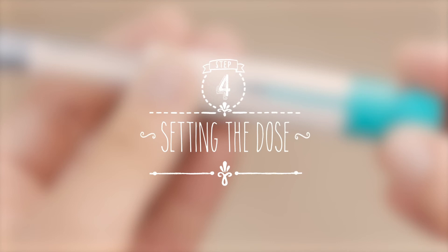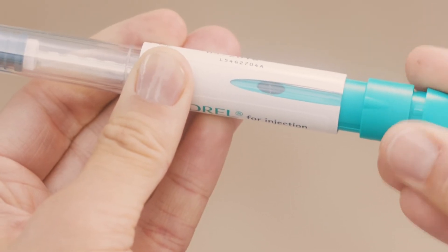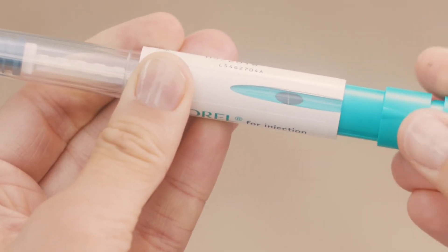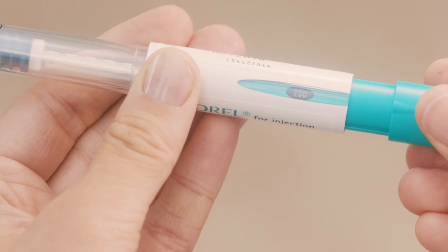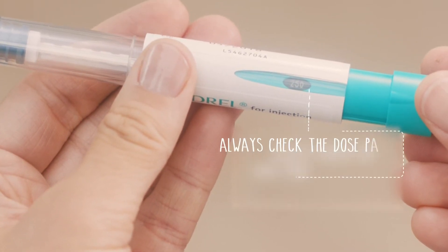Now we're ready to set the dose. Gently turn the dose setting knob clockwise — the dose display will show a straight line. Keep turning until you can read the number 250, but don't push or pull the dose setting knob while you're turning it.